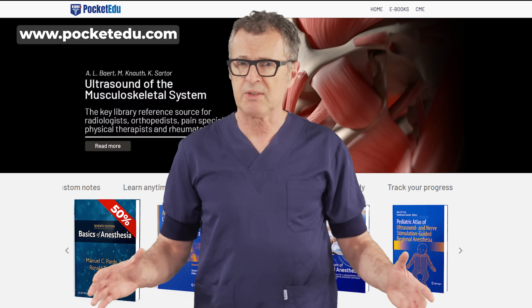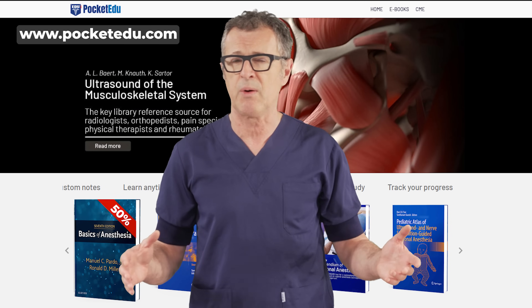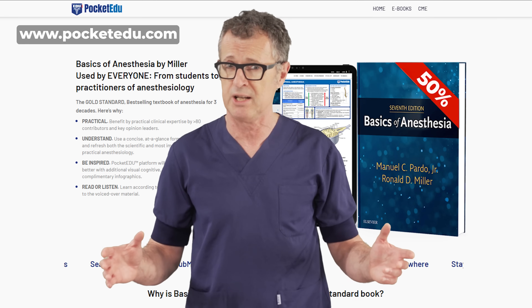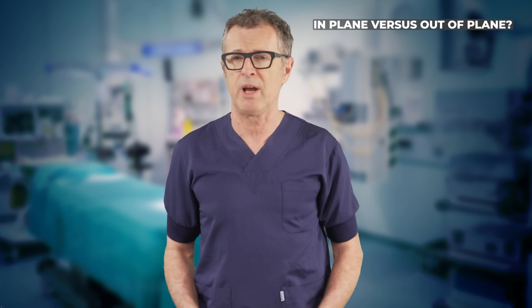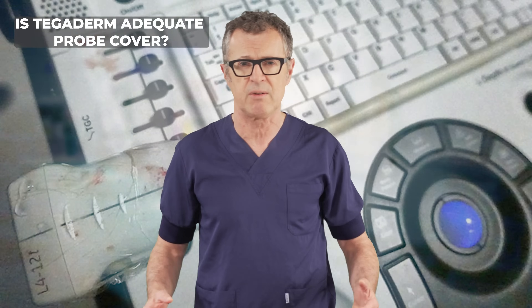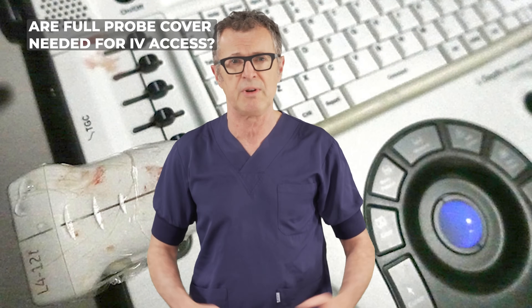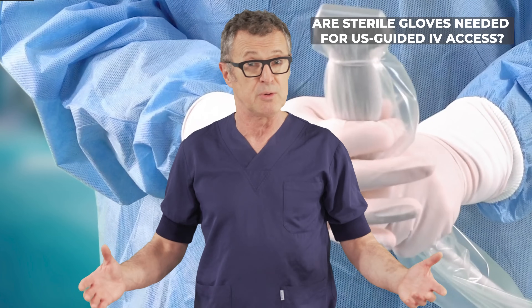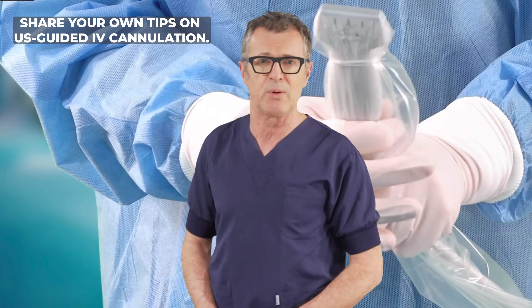That was the ultrasound-guided IV access using an out-of-plane technique. You can also read about IV techniques in Miller's Basics of Anesthesia on packetedu.com. How do you perform ultrasound-guided IV cannulation? Do you prefer an in-plane or out-of-plane technique? Is Tegaderm, as used in this video, adequate for probe protection, or do you need a full probe cover? Should the operator use sterile gloves? Share your own tips for success in the comments below.